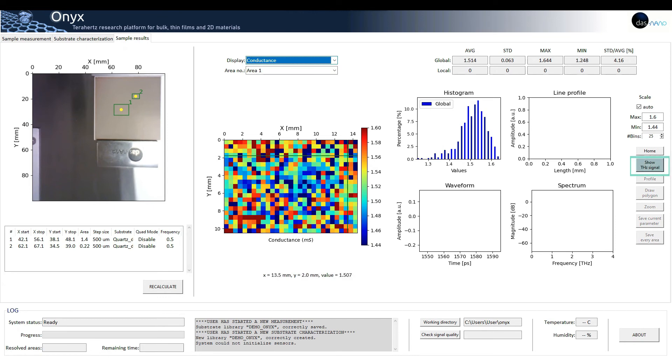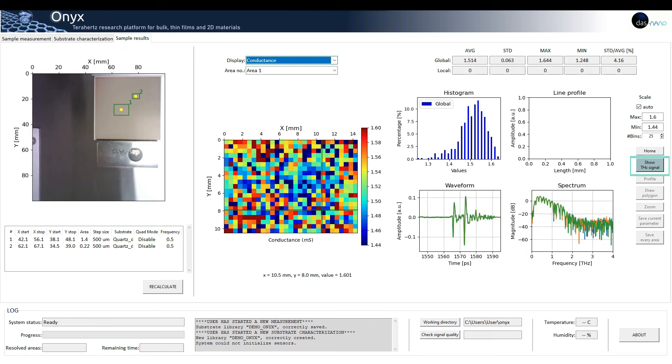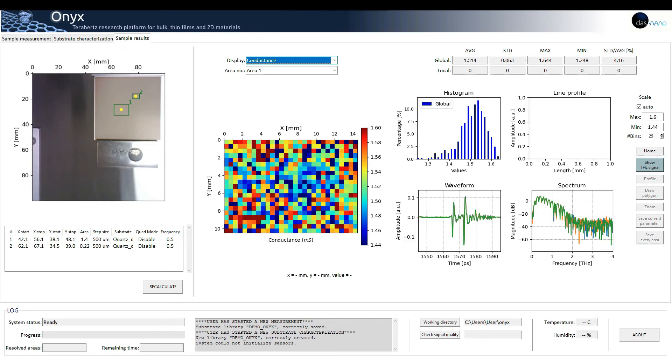Then, the detected THz signal will be represented in the time and frequency domain. As we can see in these graphs, we can zoom in the desired area.